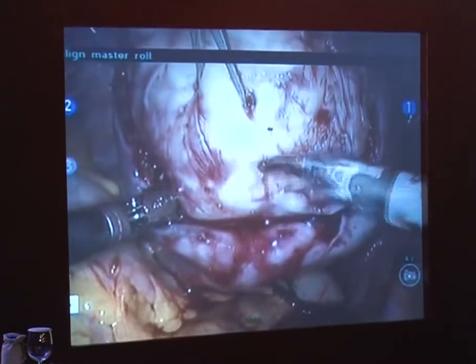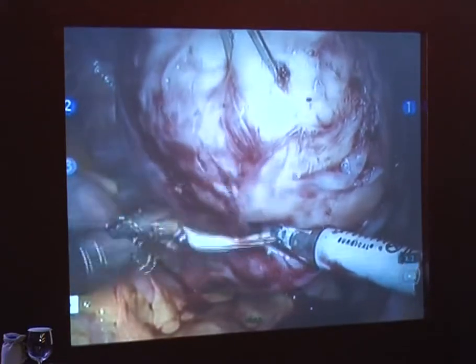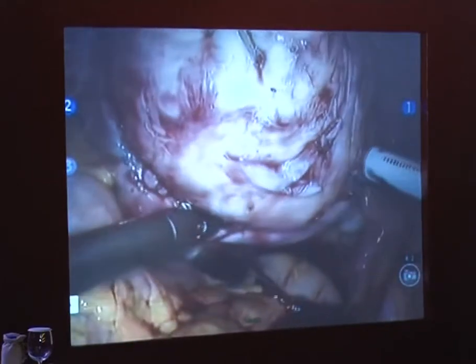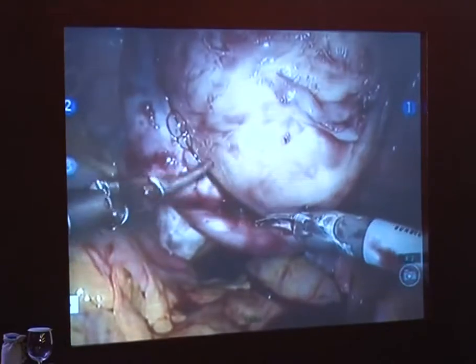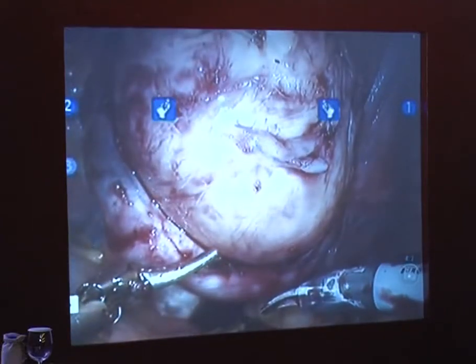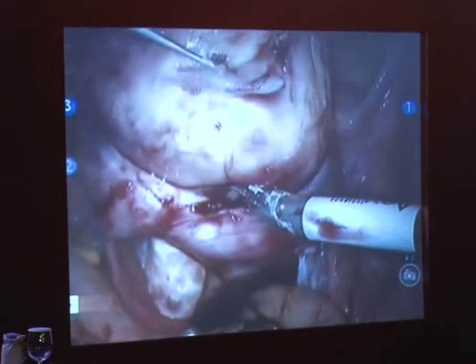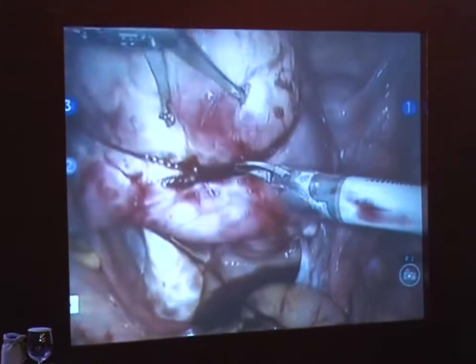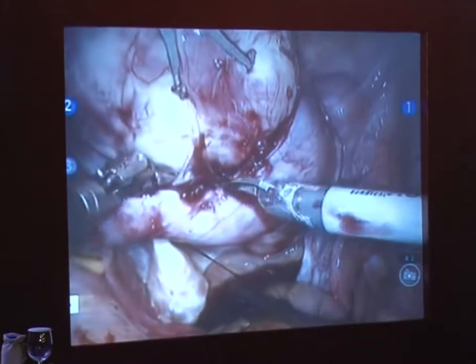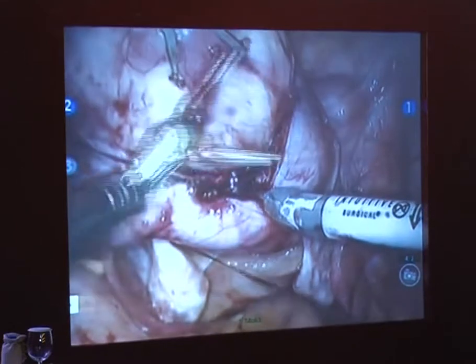Thank you. You can see I use very little electrocoagulation, electrosurgery, if I can avoid it, because the whole idea is you don't want your defect to look like a piece of burnt charcoal, which unfortunately I see in a lot of myomectomies. That's not a good way to have it at the end, because I can't imagine that's going to heal very well when it looks like charcoal like that. Go ahead and suction in here. Great, great, great, good. And I'm just slowly peeling.